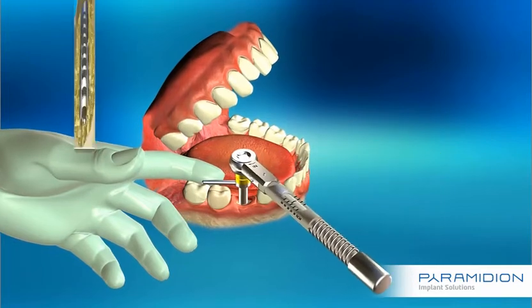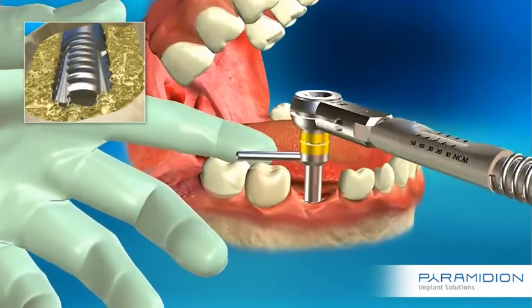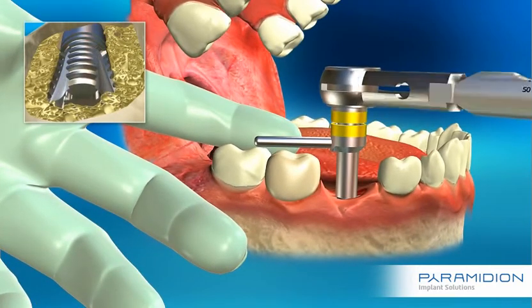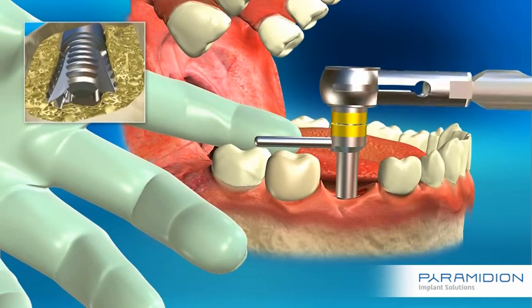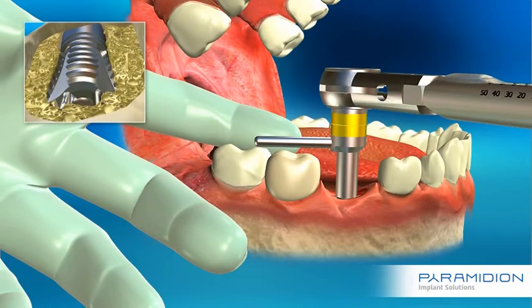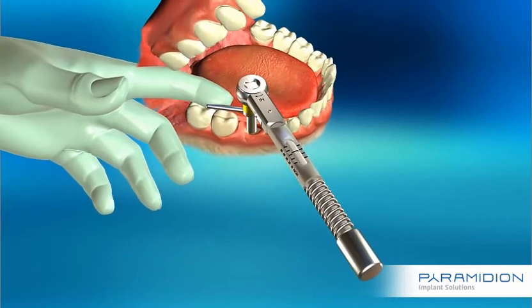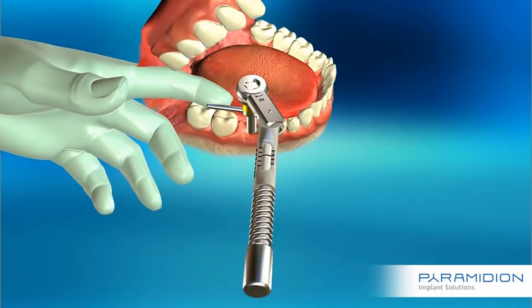With your finger, keep the short handle stationary to prevent any rotational movement by the implant during ratchet torque operation. The expansion process is completed when the two yellow rings are in contact. It is recommended to verify this by operating the torque ratchet handle until it clicks.